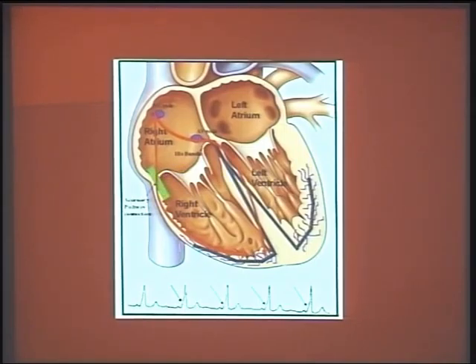Because this portion of the depolarization process is reaching the ventricle very fast, your PR interval is short. After this, once it has come to the ventricle, it is getting conducted very slowly because it is going through the muscle. That initial portion tells you the activation front which is coming through the accessory bundle. By the time it is slowly spreading, the impulse which is conducted through the normal system, after getting delayed at the AV node, gets rapidly conducted through the specialized conduction system that produces the terminal sharp portion of the QRS, which is coming through the normal conduction system.